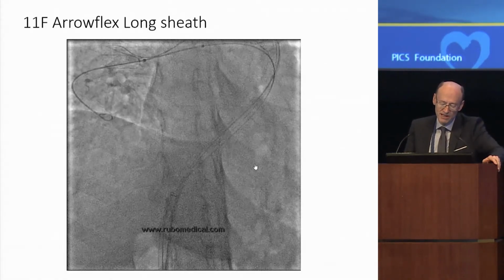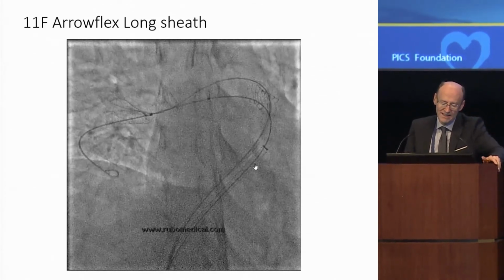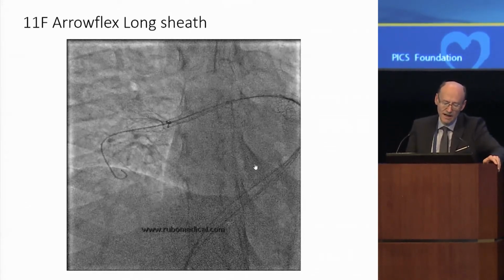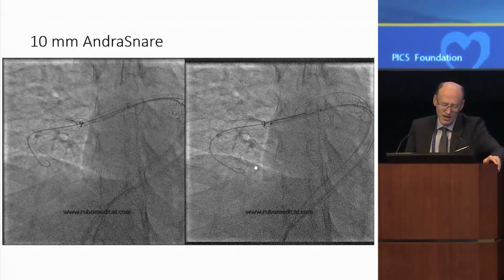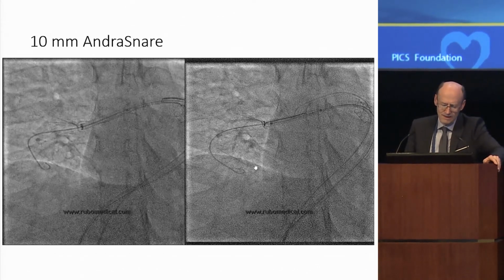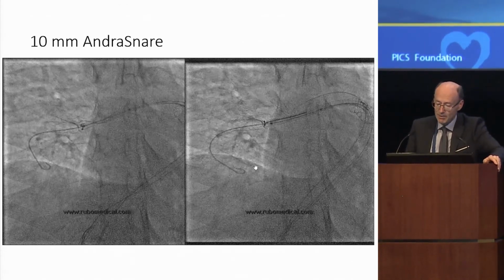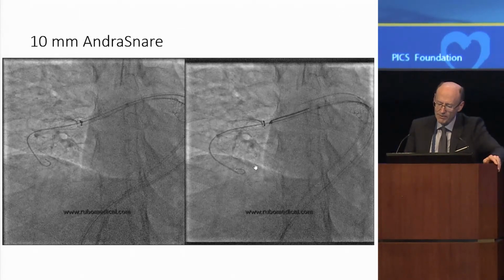Then you're able to bring a sheath up the guide wire assembly so that you can apply force at the area where the actual balloon is trapped, rather than pulling from the groin and having just curves straightening out in the heart. And then bring up a snare through that over the shaft of the balloon. So that you can get the force at the right area, and you've got the sheath stabilizing things. And then by pulling, you do eventually come free from this area.